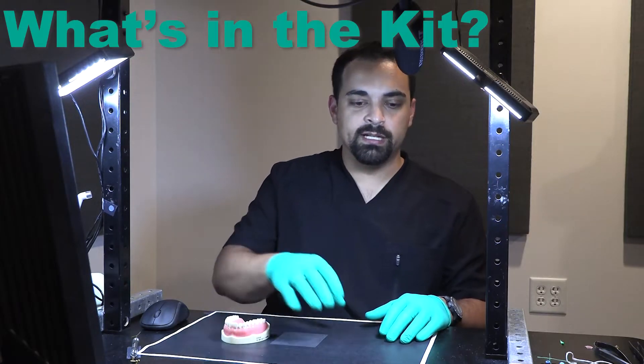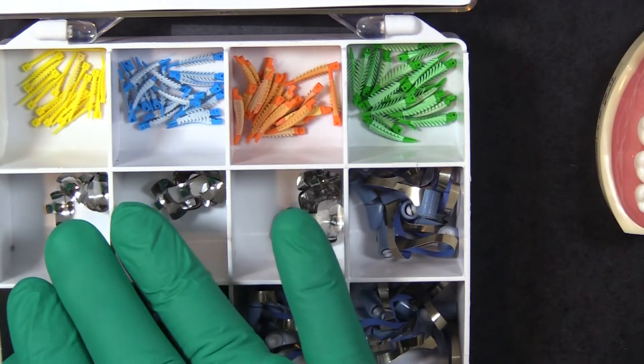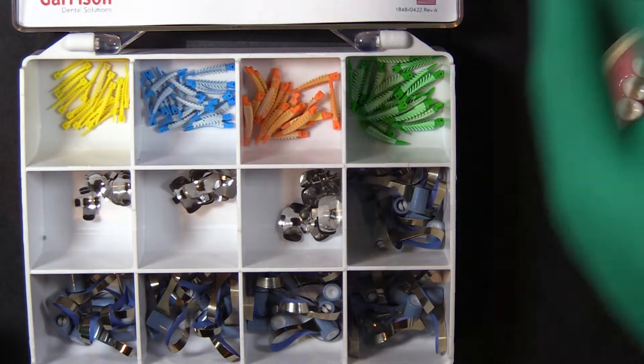First we'll go through what's actually in the kit. We have a variety of wedges, some matrix bands, and then we have these real matrix bands as well as the actual tool to use those. That's what comes in this kit.